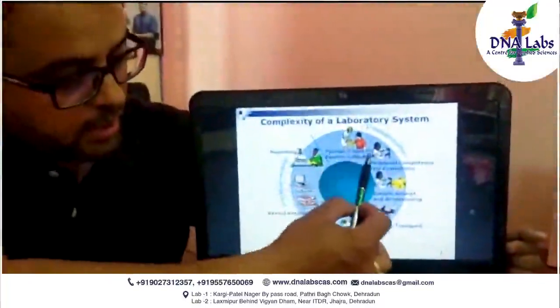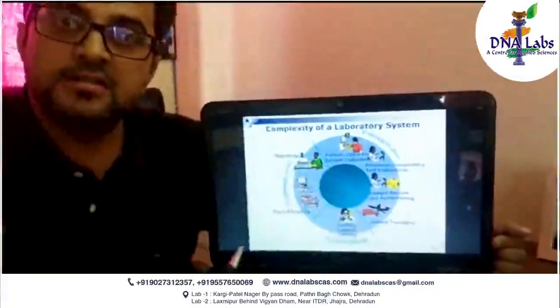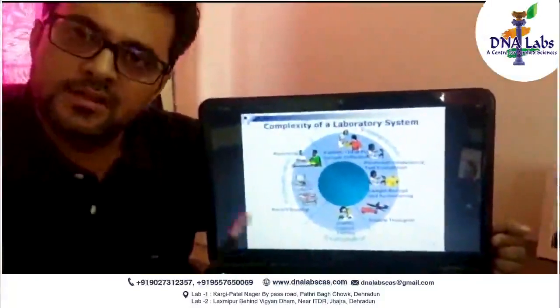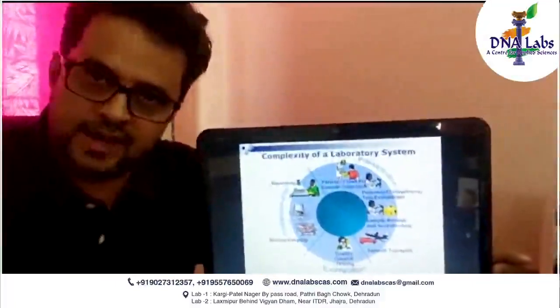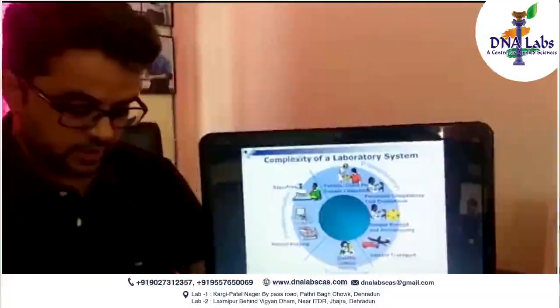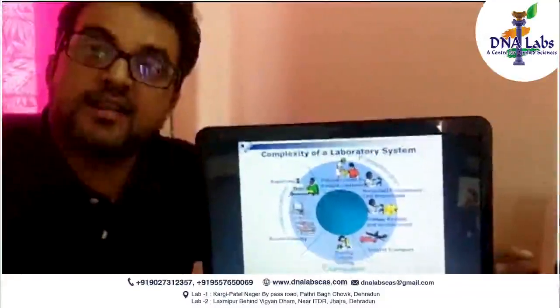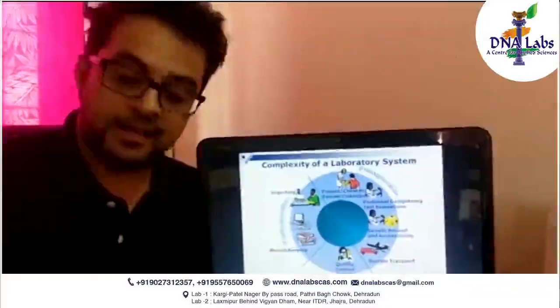For example, if you are in the diagnostic industry, the very first important thing is sample selection. Lots of mistakes come in the sample selection area only. That is also called pre-analytical error. 70 to 75% of the errors which laboratory professionals make are pre-analytical errors only.